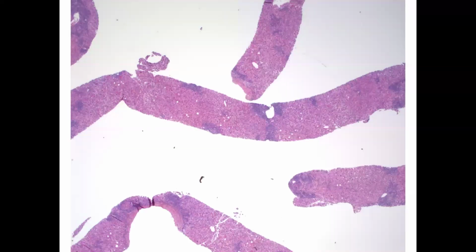This is a low power image of liver where we can see some patches of blue. And so that jumps out as something that seems different from before. We don't have any evidence of any kind of nodularity. So from low power, this isn't looking like someone who has advanced fibrosis or cirrhosis. We also don't see much fat. We don't see the pale balloon hepatocytes. We see a few fat vacuoles, but they're pretty few and far between. So it doesn't look like any kind of fatty liver disease.